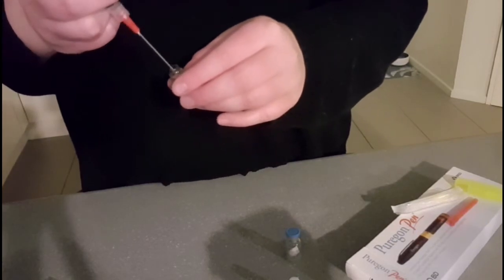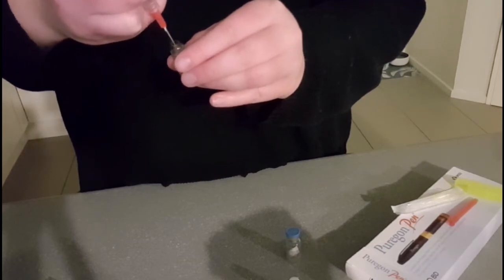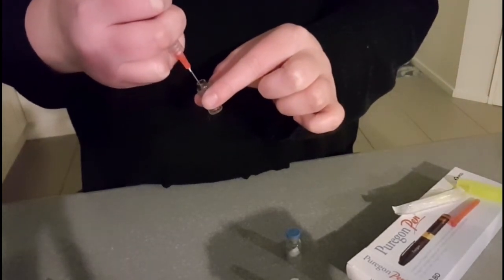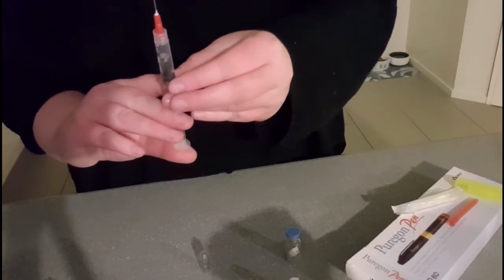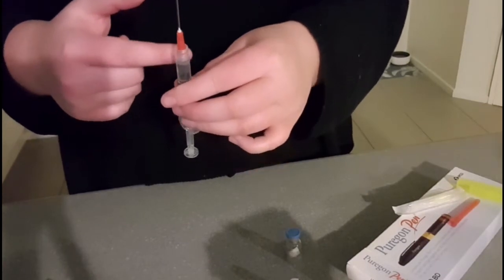Insert this into this and use your thumb to draw up the liquid. So lift, and then you've got to turn it up here and bring it up — and you just put this in the sharps bin. Bring your air bubbles up to the top. So they say set that aside — don't let the needle touch any surfaces.